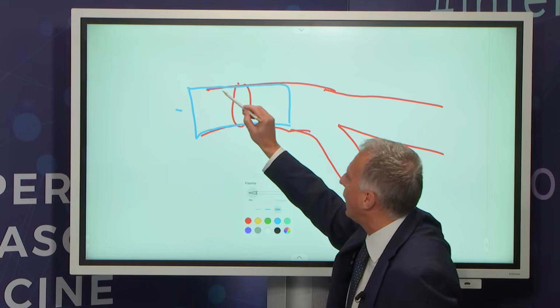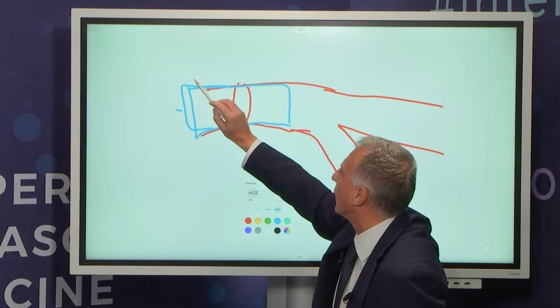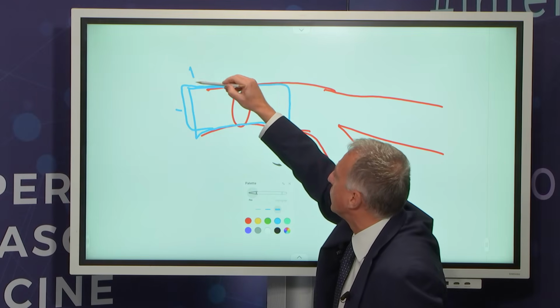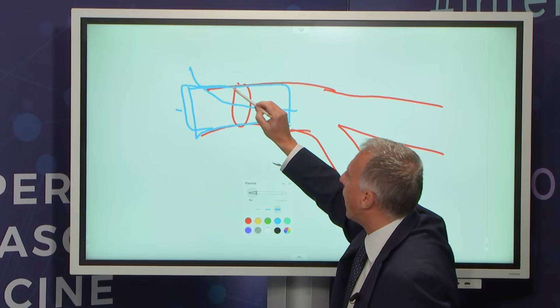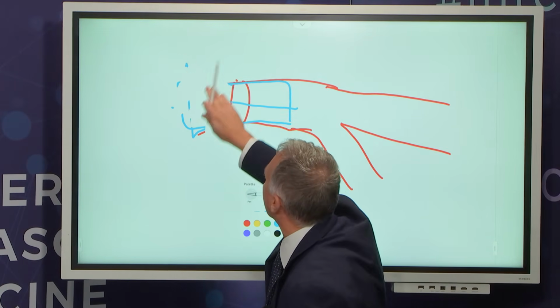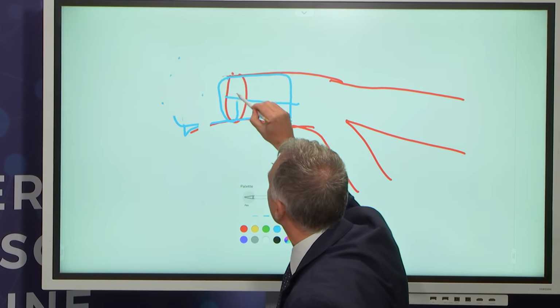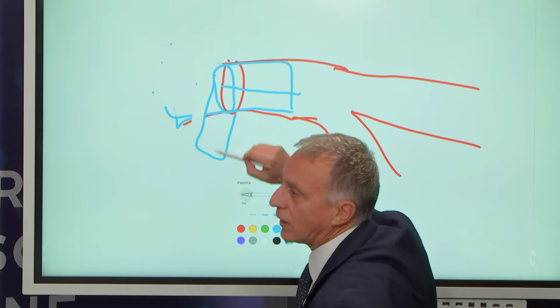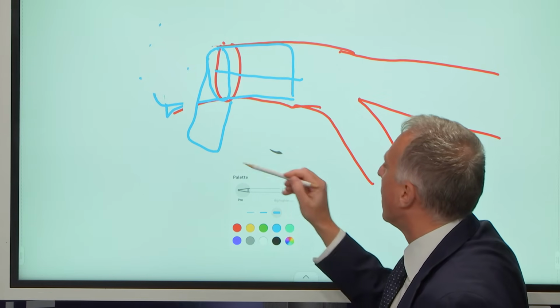So if really this is huge and you are unsuccessful in doing it, you may, as a bailout strategy, try to enter here and to balloon here in order to create a new situation where your stent is used as the side, like in bifurcation, and the part of the stent is left down and crushed down.